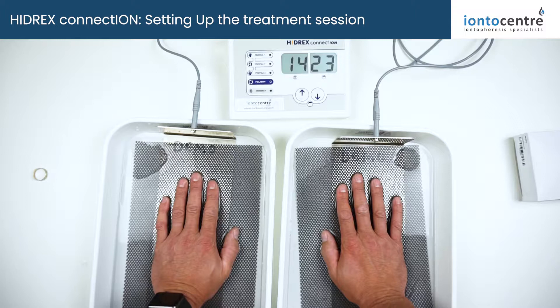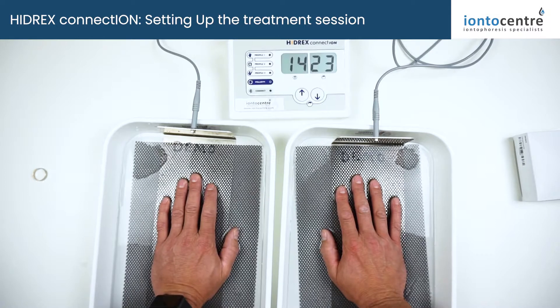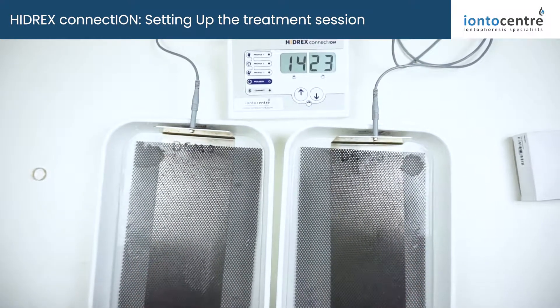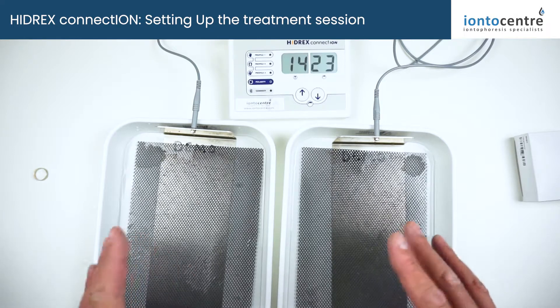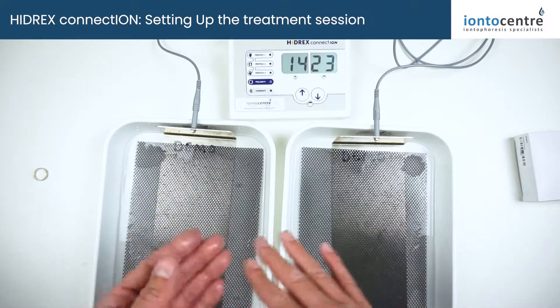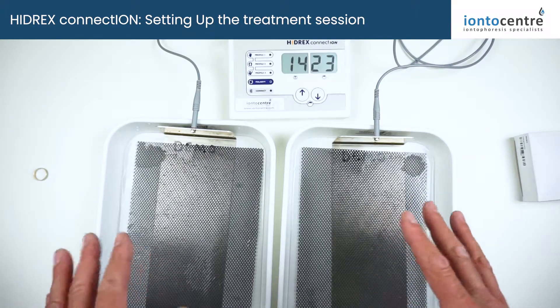The machine won't give you more than a 15-minute treatment — the recommended treatment time is 15 minutes, and the advice is to perform only one 15-minute treatment per day. If you want to treat hands and feet, you can treat them simultaneously by placing both hands in one tray and both feet in the other, treating all four extremities at once. If you need to treat underarms as well, you'll need to wait until you've finished one area before moving on. Many people find that when treating the hands, there's often automatic improvement in the underarm area as well, since the current flows through that region.